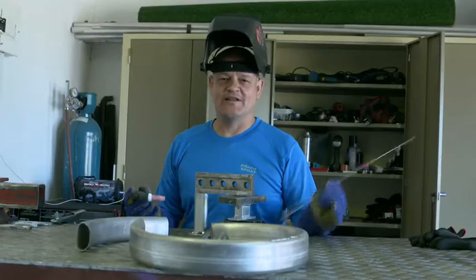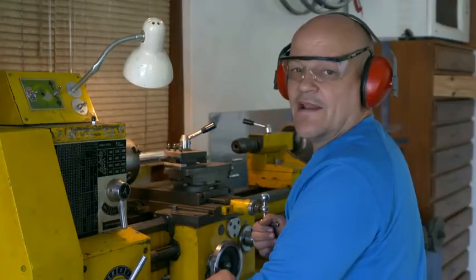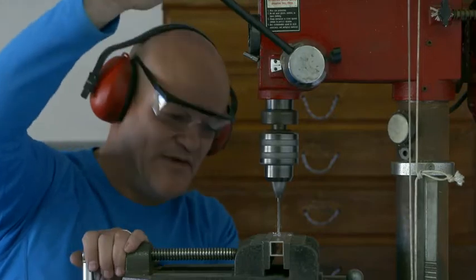I do all my own welding and all my own fabrication of parts. In fact, I do everything.